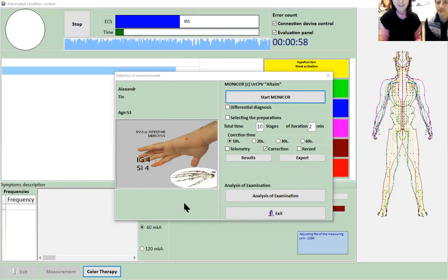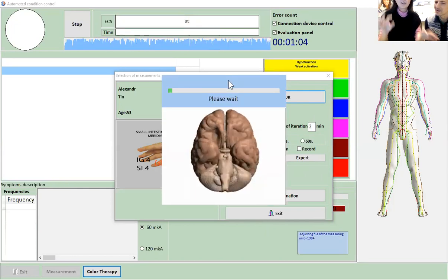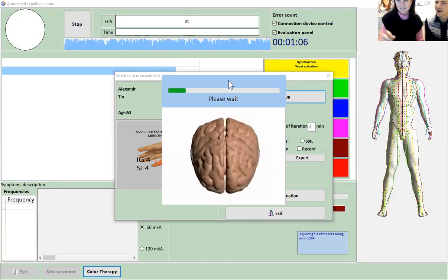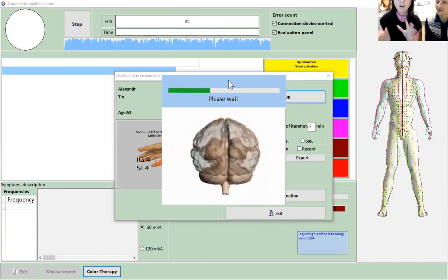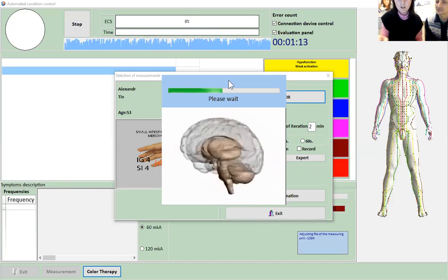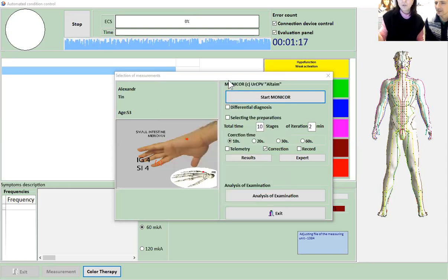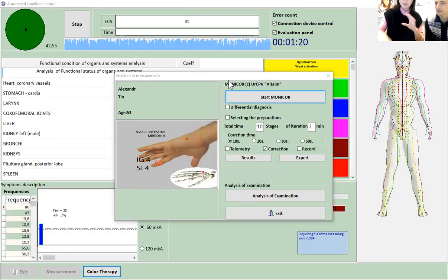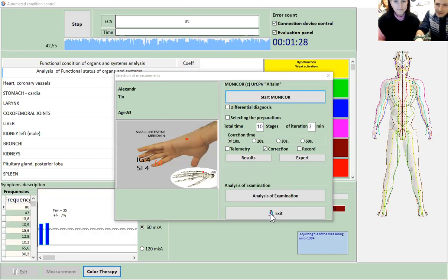Yeah. It should not be there. It's because we are using this device. So don't press anything while you're running the program. If you get some kind of pop-up window, don't press on anything because it will get stuck like ours right now. We cannot take it. Wait, he can. Which one?